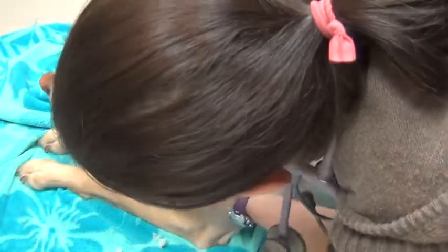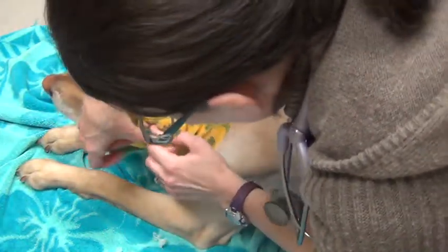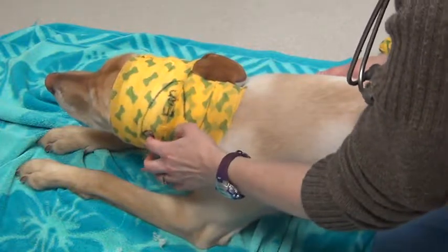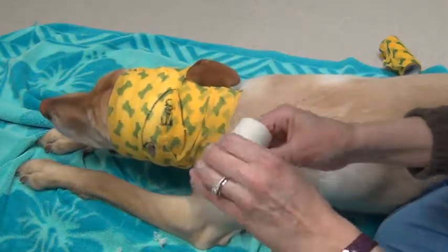Go ahead and cut a little hole here and be very careful. And I can still see underneath where I'd cut my hole in the original bandaging. So if she needs to be medicated, she can go in and have medications put in her ear, because a lot of times the hematomas are caused by deep ear infections.